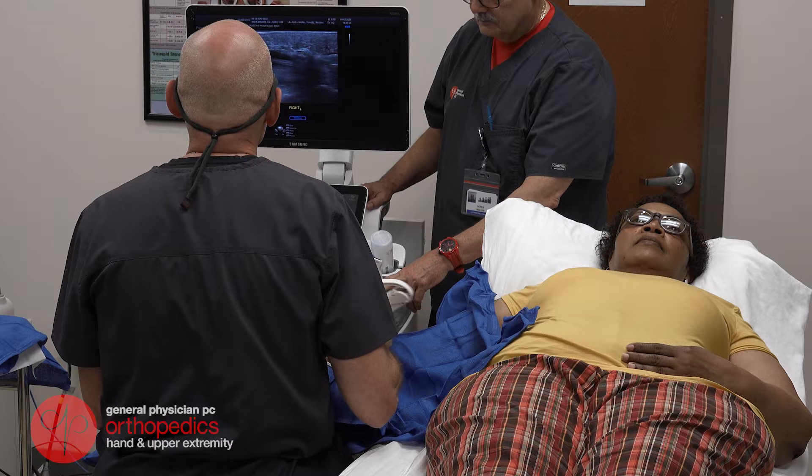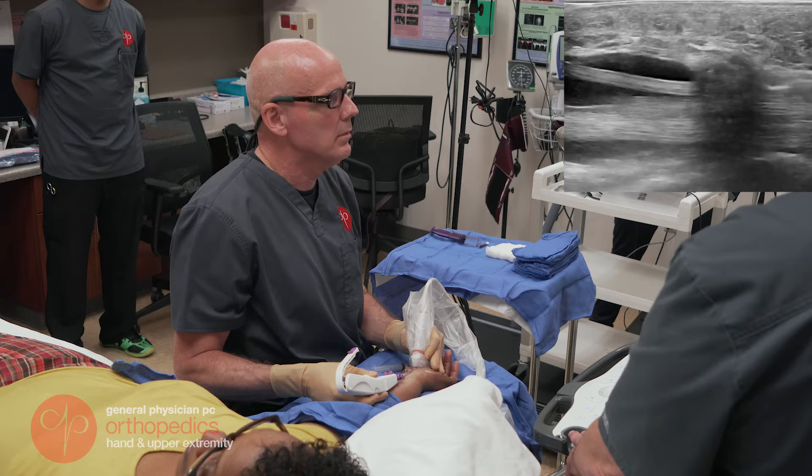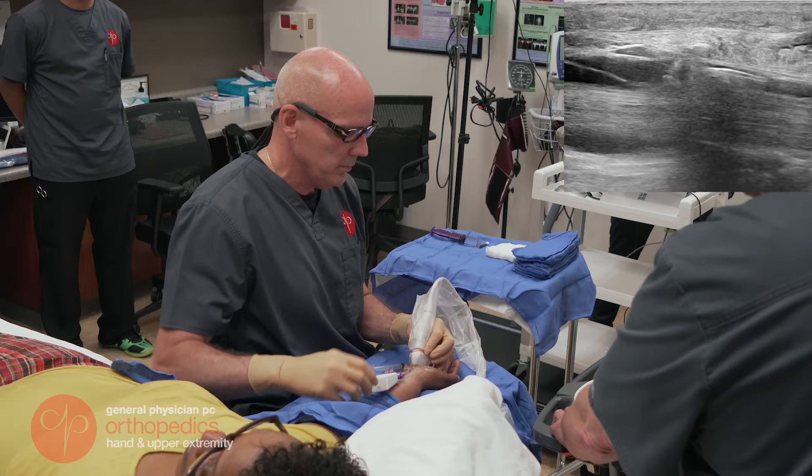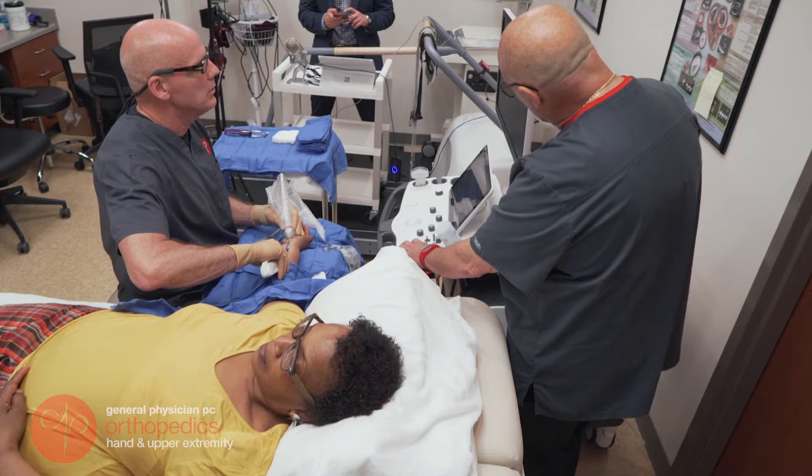Once it's inserted, I use the ultrasound to make sure that it's in what we call the safe zone. Once I confirm it's in the safe zone, I deploy some balloons that push away any vital structures. After this, I simply deploy the knife and cut the ligament.